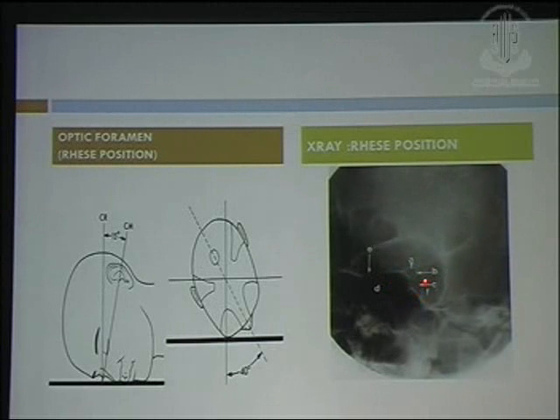This area which is marked as C is the superior orbital fissure, which is separated from it by an optic strut. Now, if you are suspecting an optic nerve lesion like a meningioma or an optic nerve glioma, you might find an enlargement of this optic foramen area, and you can compare the other side and can probably suspect a pathology. Or otherwise, if you are suspecting a trauma and a fracture of the optic canal, probably you can pick up that in this one of the simpler techniques.